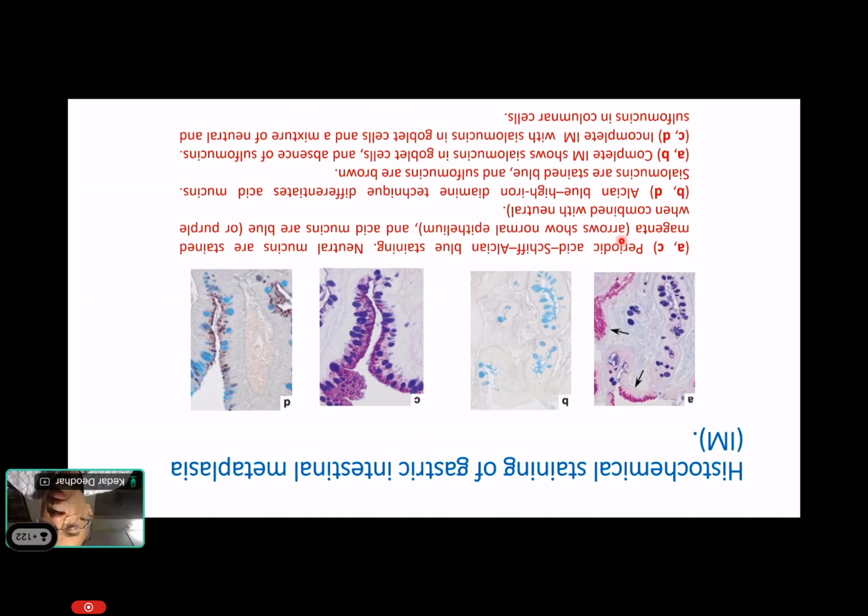On the left side, we can see these blue points, which are the goblet cells, telling us that there is intestinal metaplasia. These will be the same. The sulfated mucins with high iron diamine are stained brownish in tinge. So these are some examples of sulfated mucin staining by high iron diamine. They are types of acidic mucin, and although we don't use it normally, the connotation is that they are usually seen in dysplasia or adenocarcinomas.